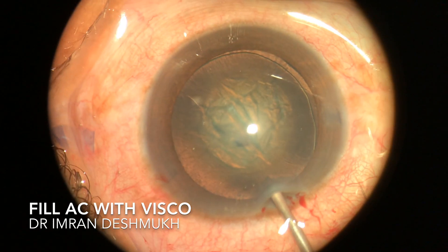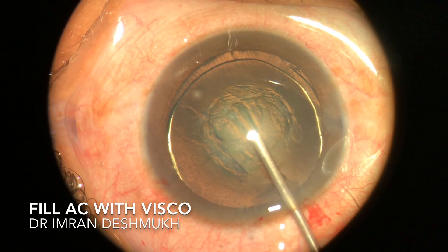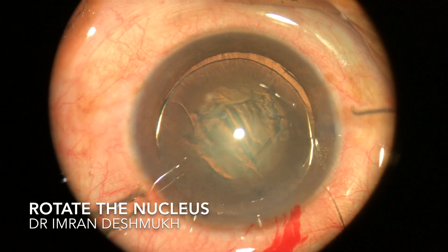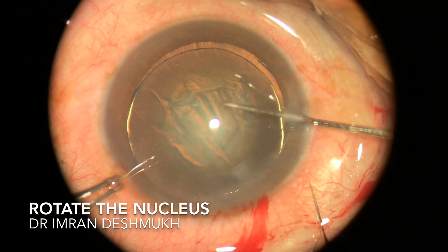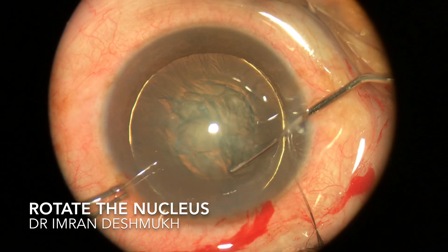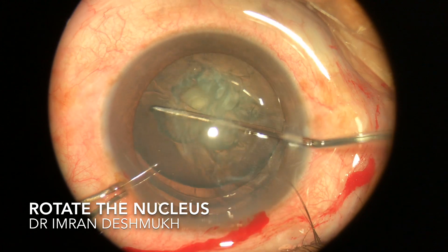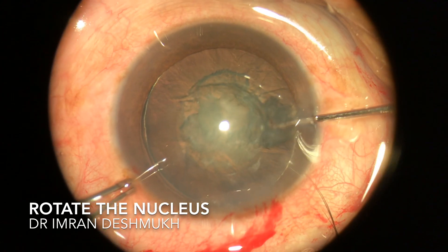Once you have completed hydro, fill the anterior chamber with visco so that rotating the nucleus becomes very easy and you have plenty of space. Take your Sinskey hook, enter through the side port, and gently rotate the nucleus. You don't want to apply a lot of pressure because that can damage the zonules. Gently rotate it 180 to 360 degrees.